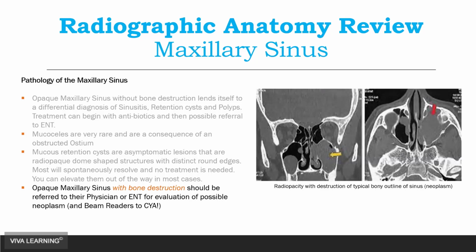Now, one thing to consider, if you're sending all of your cases to an oral maxillofacial radiologist, there's nothing wrong with that. It's just going to get kind of expensive. I still send probably about 4 or 5 cases a year, out of the hundreds that I view, to a radiologist, almost as a cover-your-butt kind of thing. Because if there is some pathology, I want to have the liability of that passed on to a specialist in radiology. And so once you send your radiograph to a radiologist, you are no longer liable for things that could be missed in the scan.